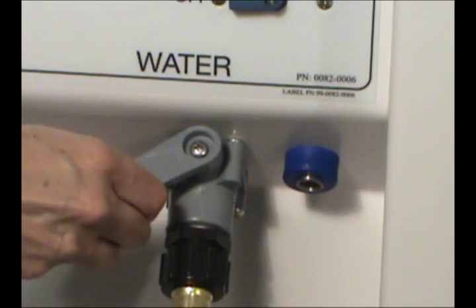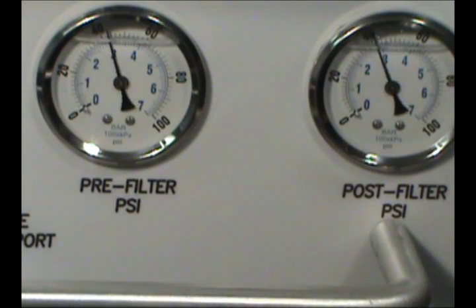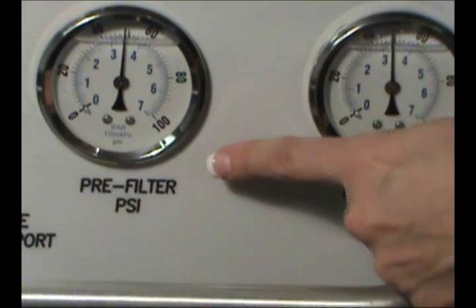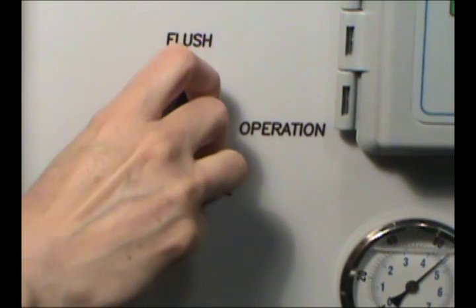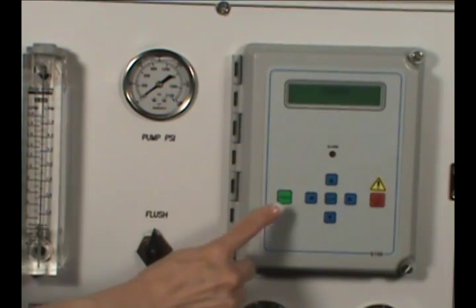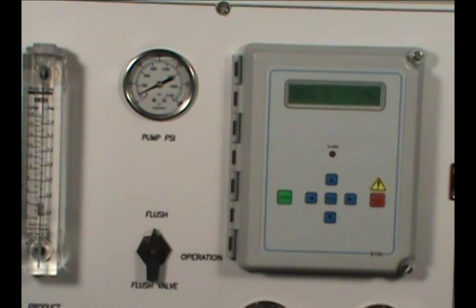To begin operation, turn on the tap water supply. Check the pressure gauge on the front of the RO to verify you have water pressure. Turn the flush valve on the RO to the flush position. Push the green power keypad on the RO control panel to start the unit.